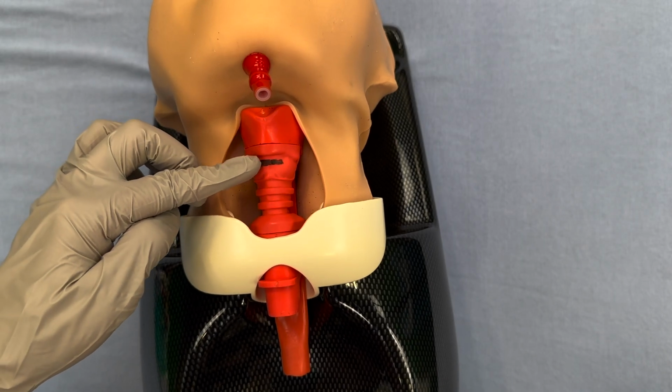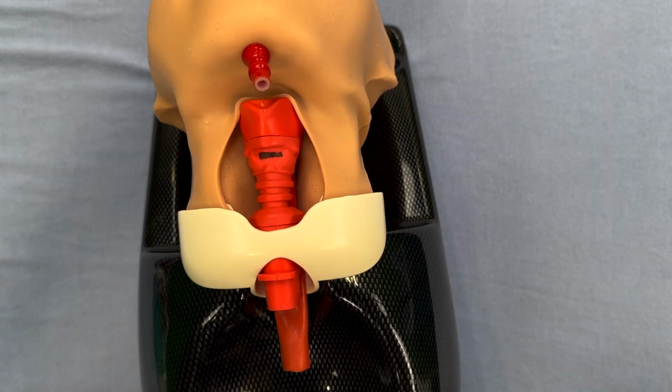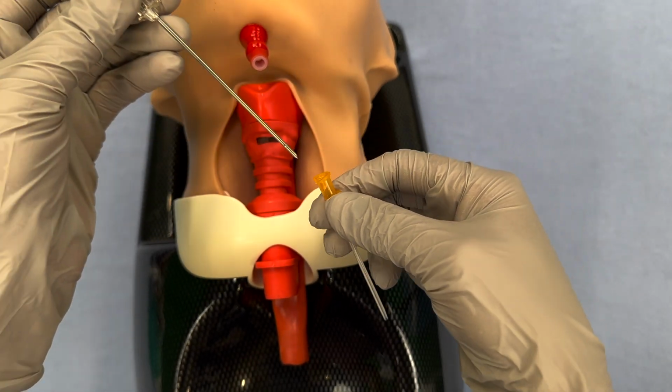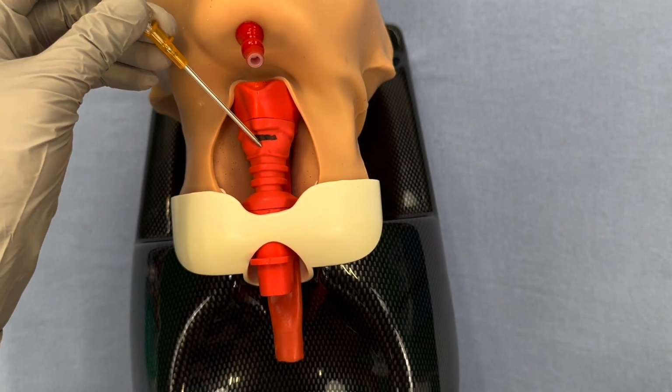But here in a child, you can see the space is much smaller, and you can barely see the cricothyroid membrane. There's only enough space for a small catheter to be passed through without damaging the cartilages. So for a pediatric patient, we'll be passing an IV catheter over a needle, which is why it's called a needle cricothyrotomy, or needle cric for short.